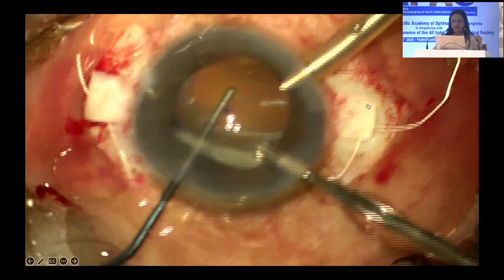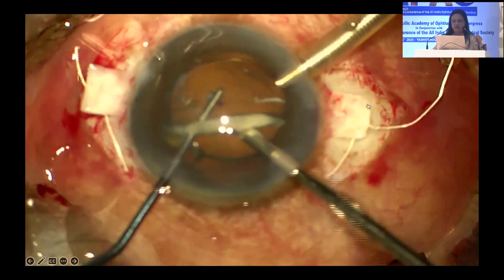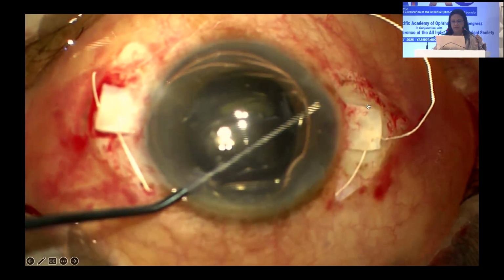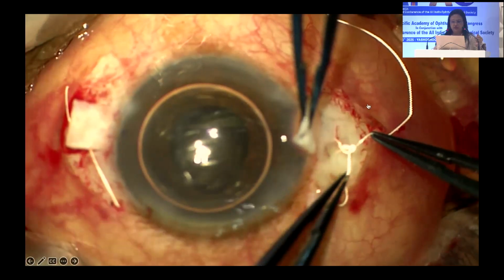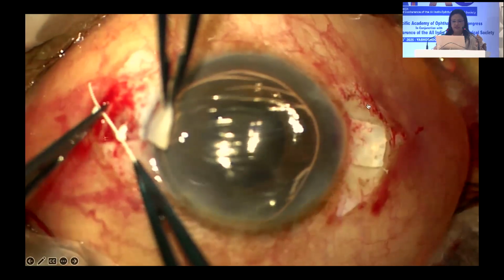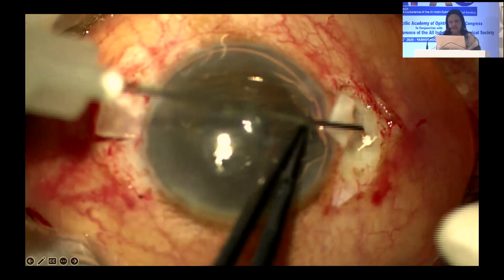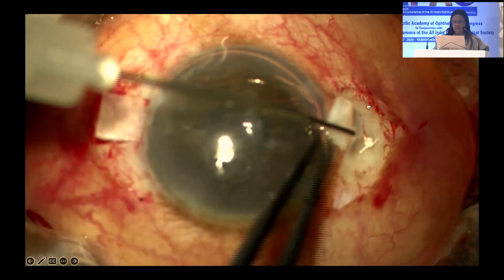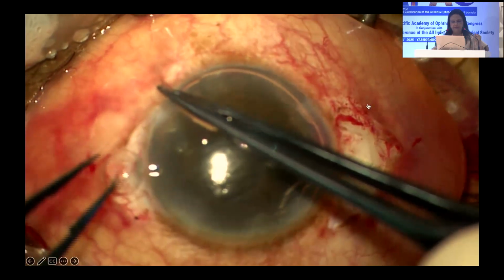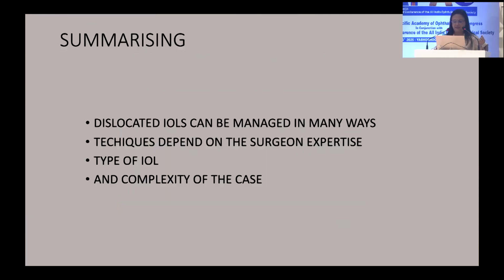Once we got the Soemmering ring out, we did an anterior vitrectomy and, using a vitrector, we removed the Soemmering ring. And I'm just checking to see if there's any vitreous, and just tightening the sutures. It would be better to bury these sutures, because they are very big and the knots can be quite big, but because it's under the flap, it's okay. So now I've glued the flap and also the conjunctiva, and the procedure is complete.